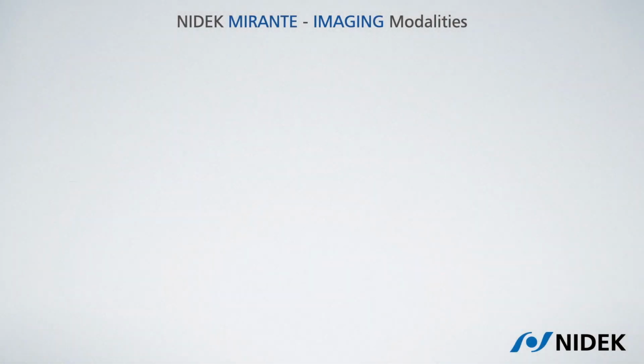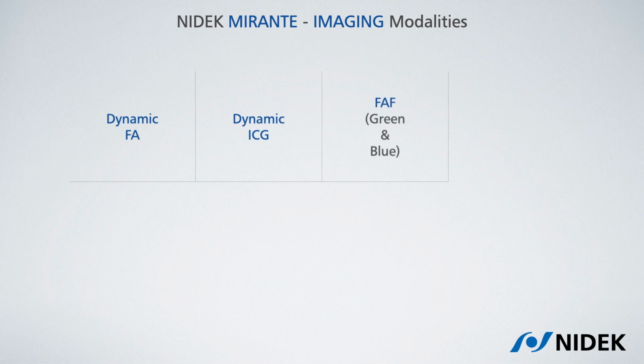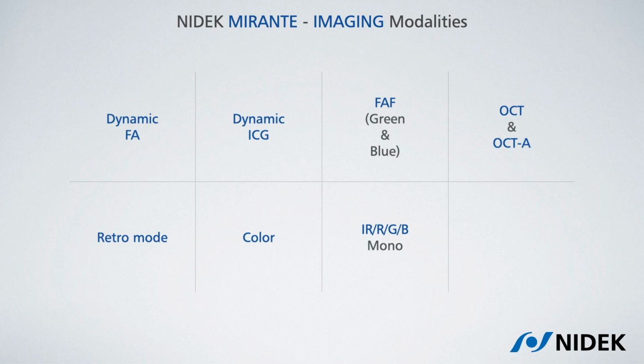So here is what you can do with the NIDEK Mirante. Dynamic SLO-based fluorescein angiography, dynamic SLO-based indocyanine angiography, green and blue autofluorescence, OCT and OCT angiography, retromode imaging, color imaging, monochromatic imaging for infrared, red, green and blue, and ultra-wide field for FA, ICG, color and retromode.